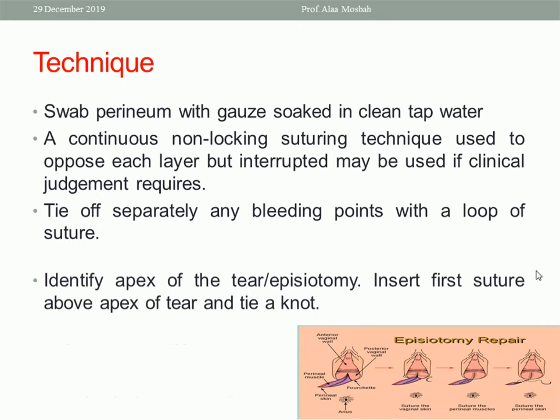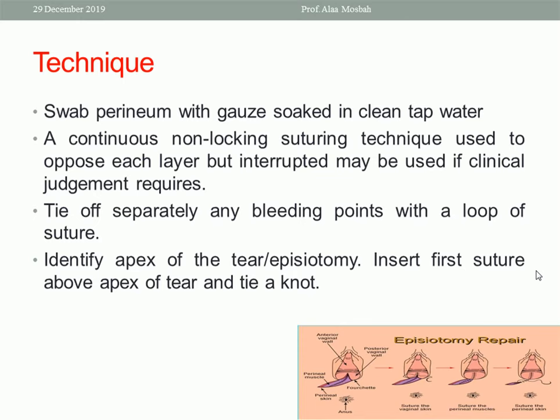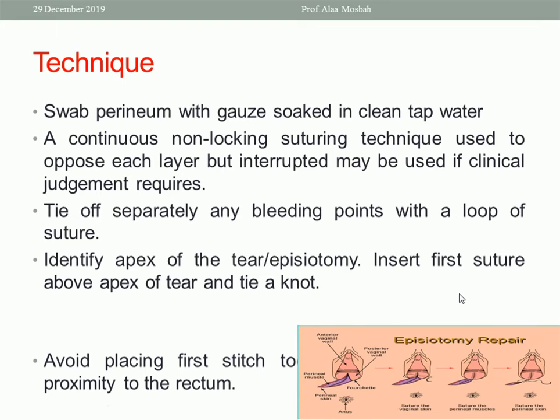Identify apex of the tear, or episiotomy. Insert first the suture above apex of tear and then tie a knot. So I'll start above the apex of the episiotomy. It is very important. And then tie a knot.